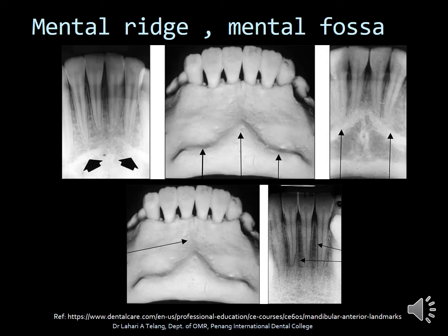The mental ridge is a dense radiopaque structure visible as radio-opaque lines indicating the shape of the bone. The mental fossa is the radiolucent area seen in this radiograph. You can also see the lingual foramen in this radiograph.